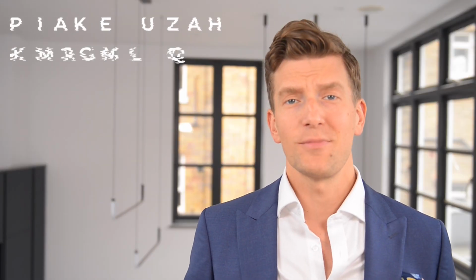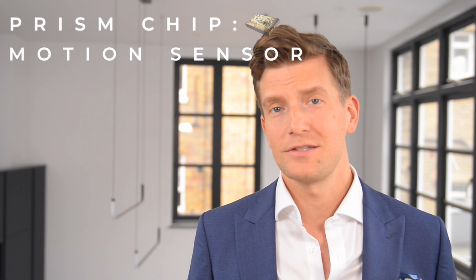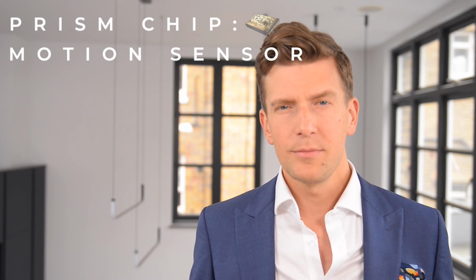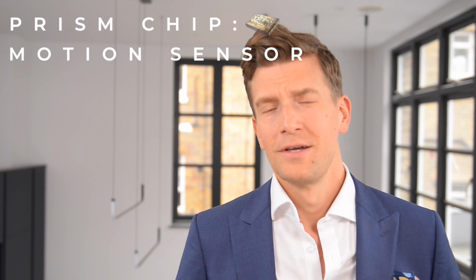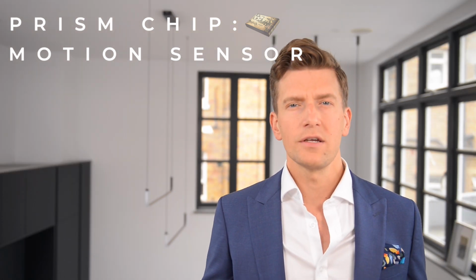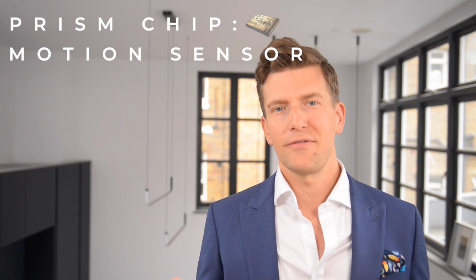Phonak have made a really smart move by introducing motion sensors onto the Paradise range. And you might be thinking, why do my hearing aids need to know if I'm moving or not? And it's a really good question. The reason being is that if you're moving, you're likely to be wanting to listen to different things.